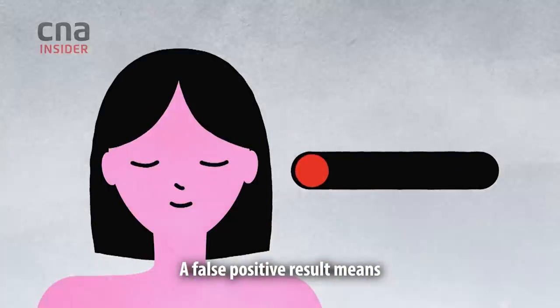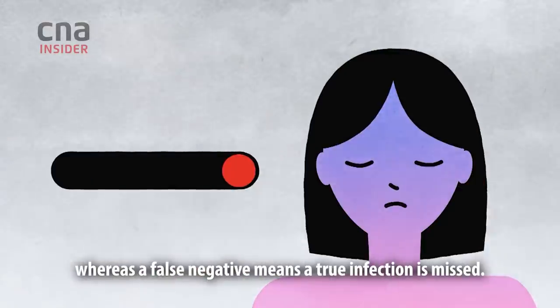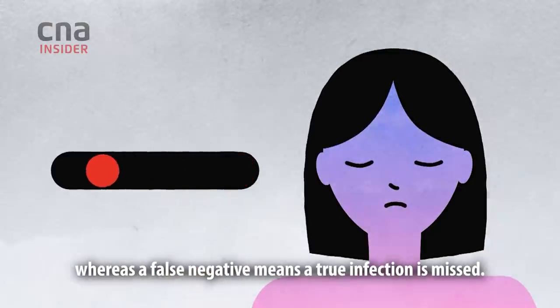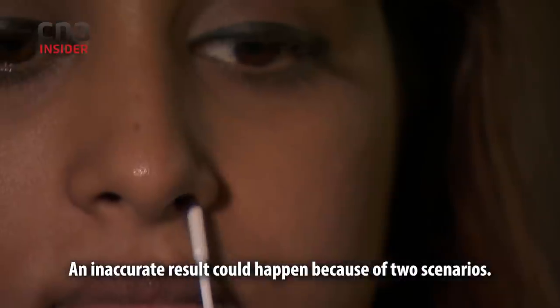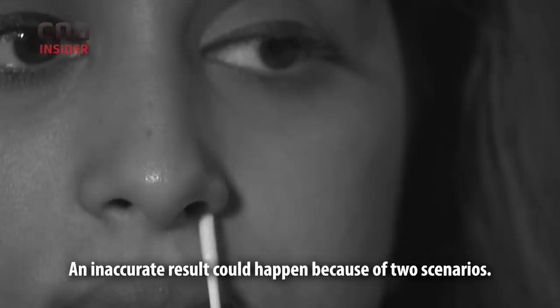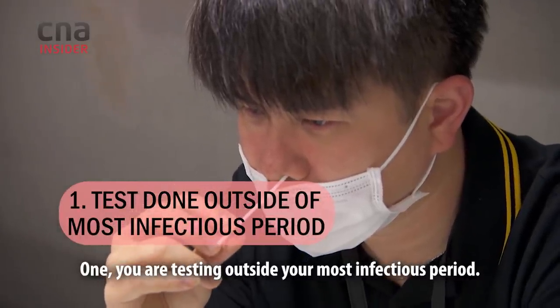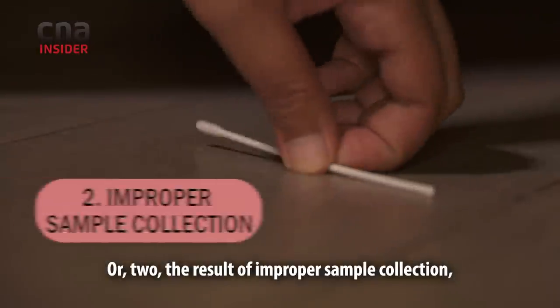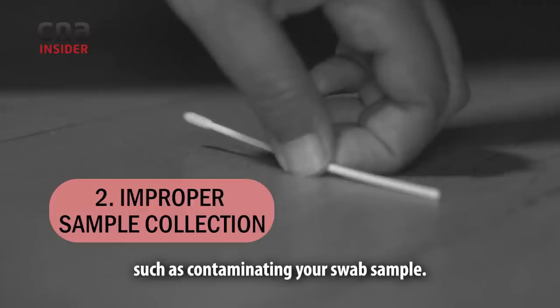A false positive result means that a person is wrongly diagnosed as infected, whereas a false negative means a true infection is missed. An inaccurate result could happen because of two scenarios: one, you are testing outside your most infectious period; or two, the result of improper sample collection, such as contaminating your swab sample.